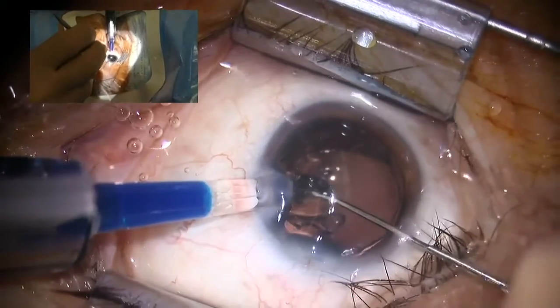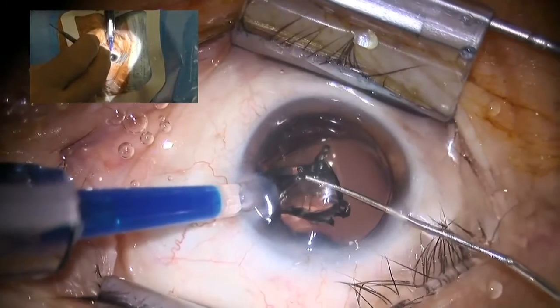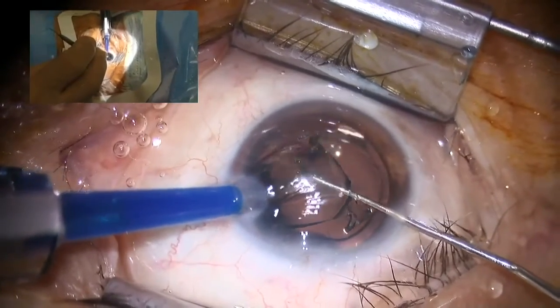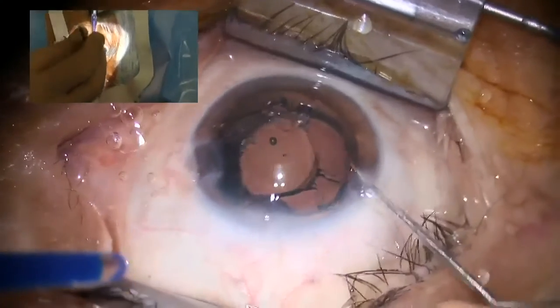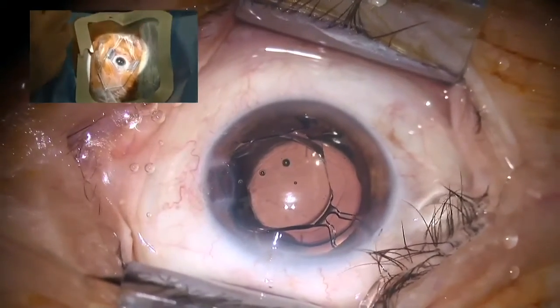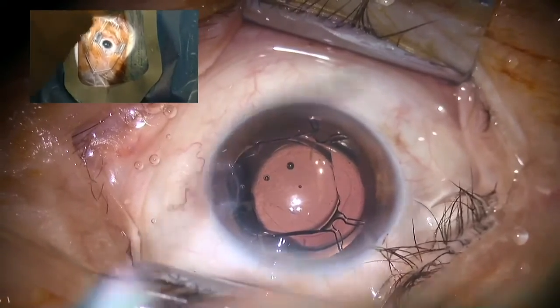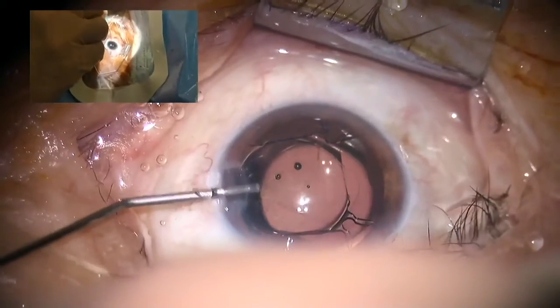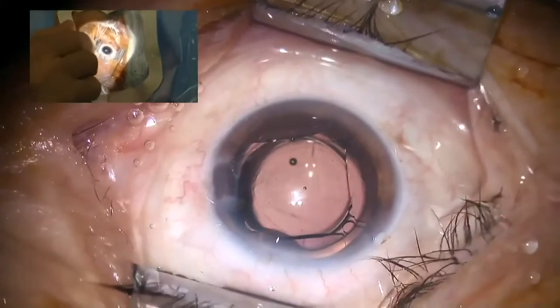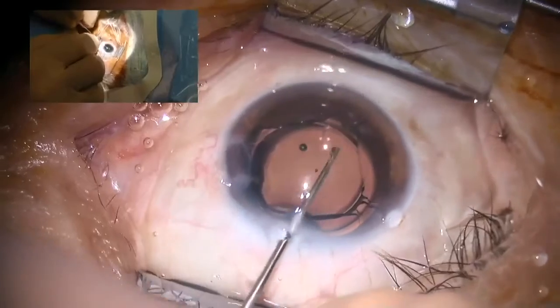The other reason you probably see now, because I go with my second instrument underneath the optic to lead the unfolding process inside the AC to avoid that the haptics go underneath. Now you see our first haptic is still underneath the iris.